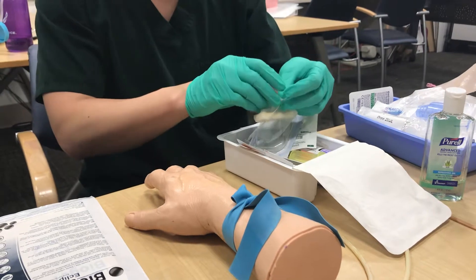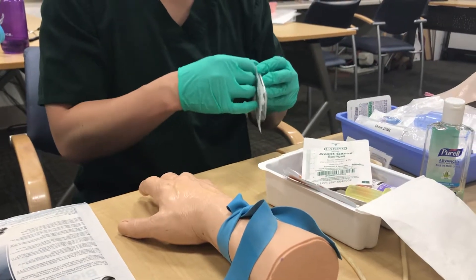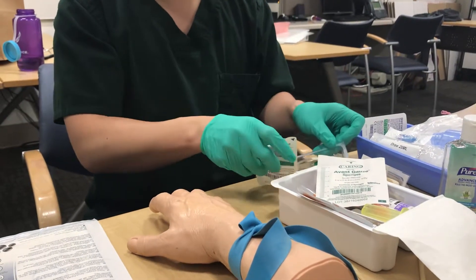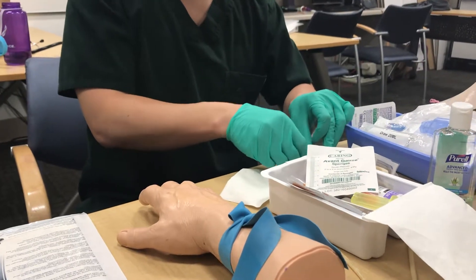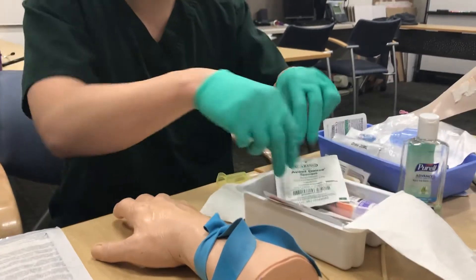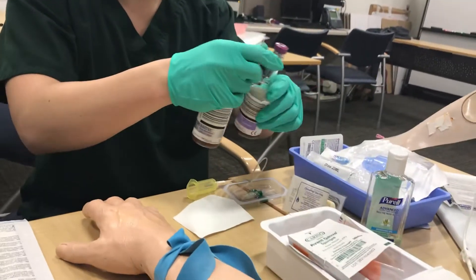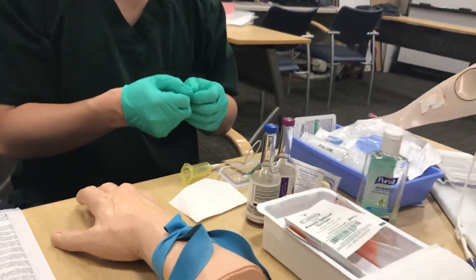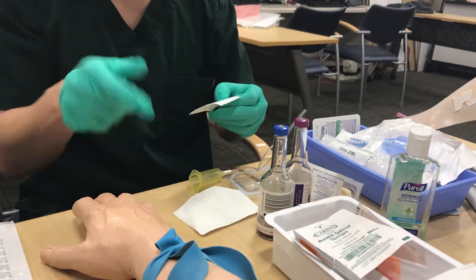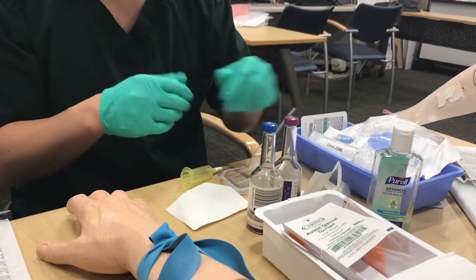If you need to re-palpate the site, you're going to have to put on your sterile pair of gloves. While you're letting it dry, open up your kit, open up your needle point, and attach it to your adapter. Make sure you have labels attached for the patient — always verify the patient's name and social or MR number before you start.